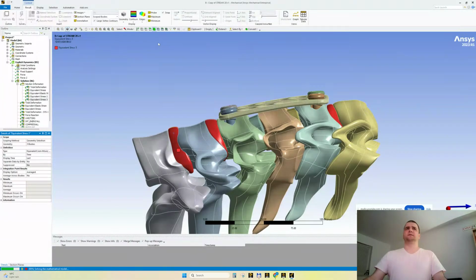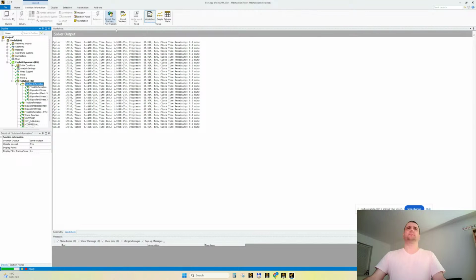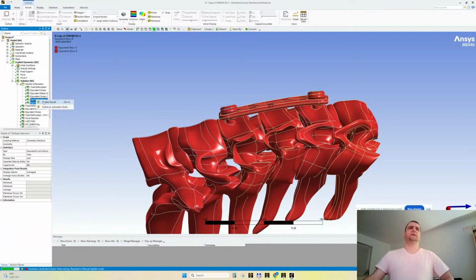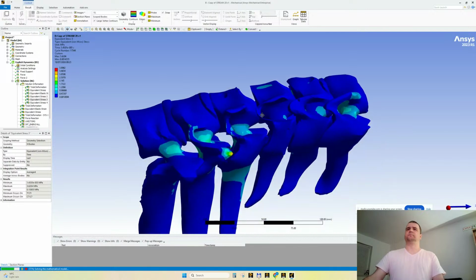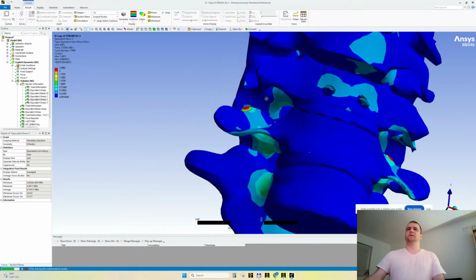And harder bodies, let's also include these ones, the bones. Now let's deal with the harder bodies, and now the plots will make sense. Right-click, switch to automatic mode. So look here, the plots for the softer bodies, softer compared to the titanium. Yeah, they are clearly touching here.